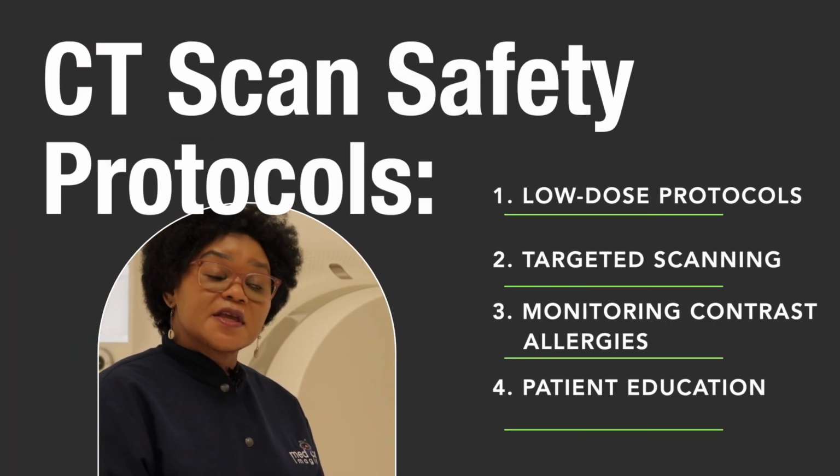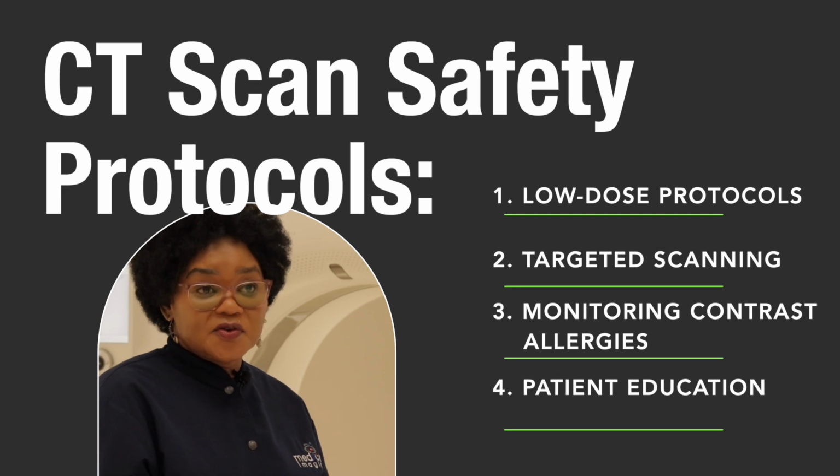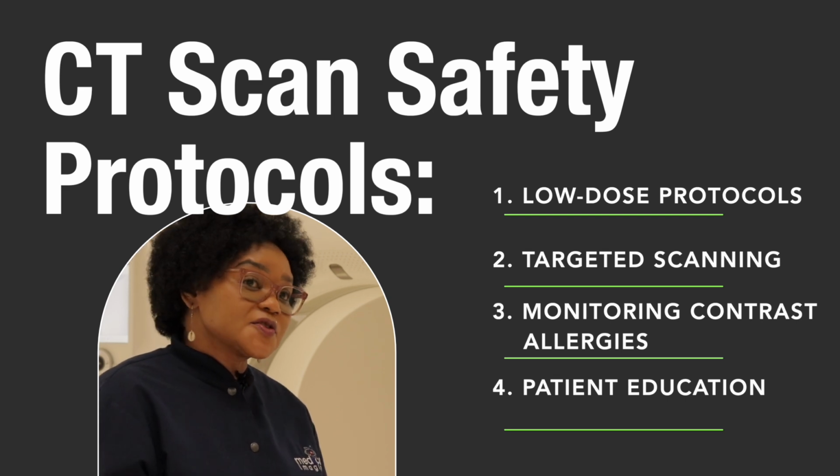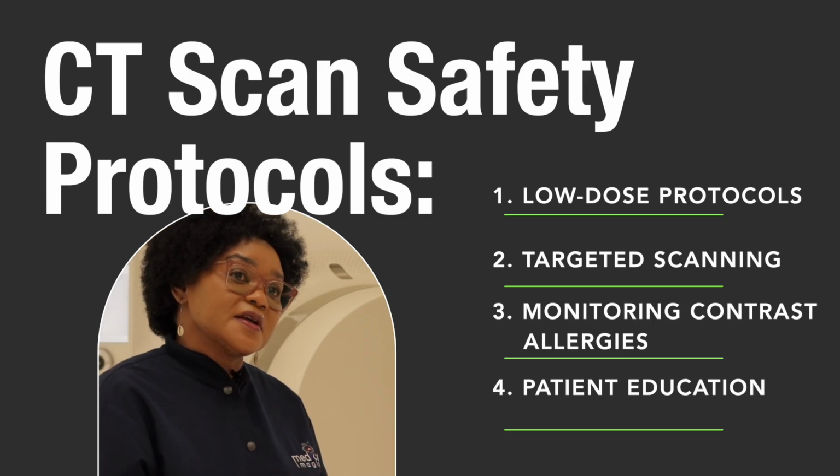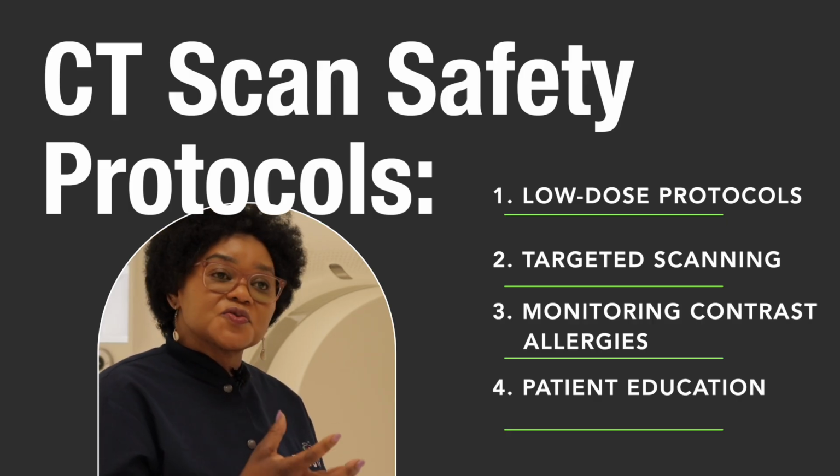We give contrast medium that has iodine in it, and there are people who are allergic to that. But before we inject contrast medium into a patient, we make sure they are not allergic. And if they are allergic, we give them pre-medication that will stop the reaction, that will cause the patient not to react. So the risks are quite minimal because we follow procedures to avoid anything that will harm the patient.